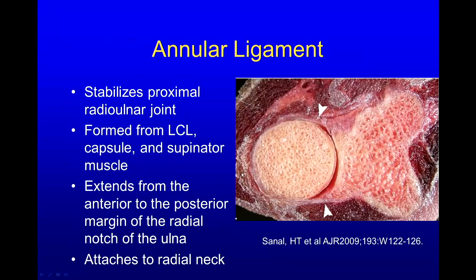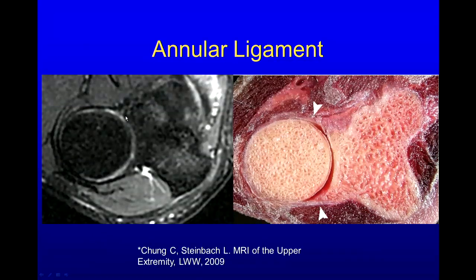Here's our annular ligament surrounding the radial head. It stabilizes the proximal radioulnar joint and is formed from the lateral collateral ligament capsule and supinator muscle. It goes around the radial head from the anterior and posterior margins of the radial notch and attaches to the radial neck. You can see this ligament on many MRs; sometimes if you don't see it, that's okay, as long as you don't have obvious disruption or fluid getting out in the back.